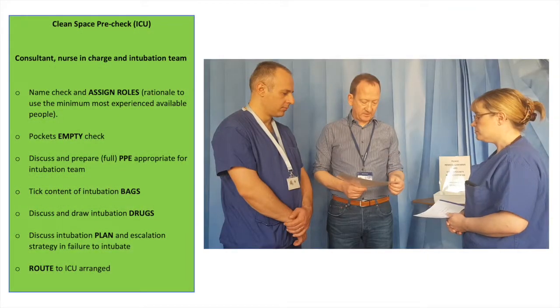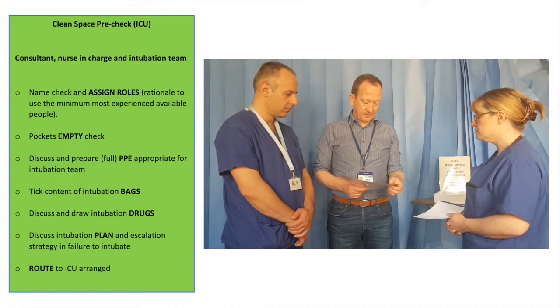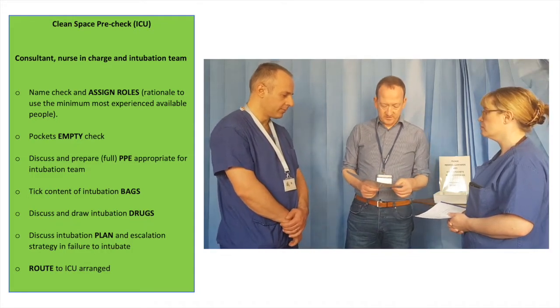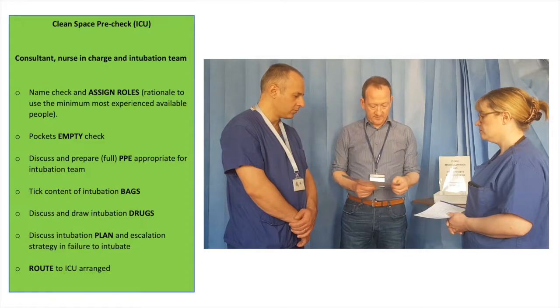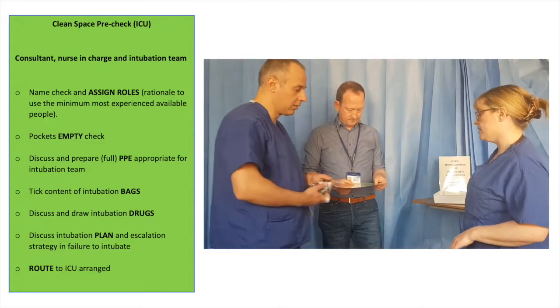Okay, so we can go through our checklist. So we're going to assign roles. Sam, are you going to be our... Yeah, I'm happy to intubate. Let's just intubate at the moment, and Sue will assist, and we'll send a third member of the team down as well as backup. Have you emptied your pockets? Yeah, I'll take my stuff. I've just got my big hat that I will wear.